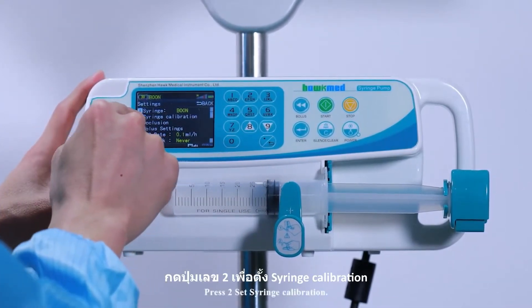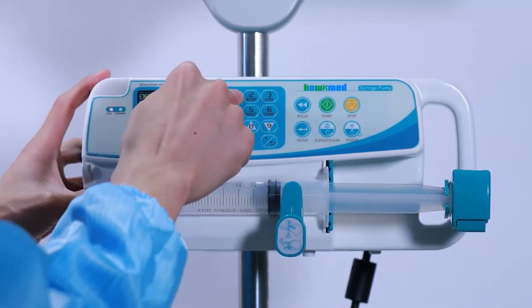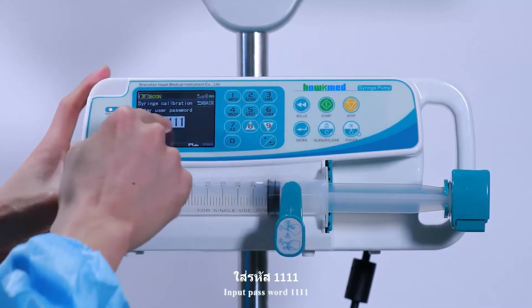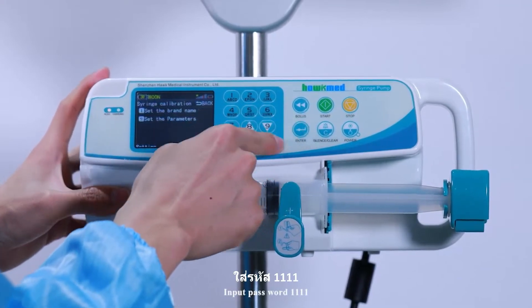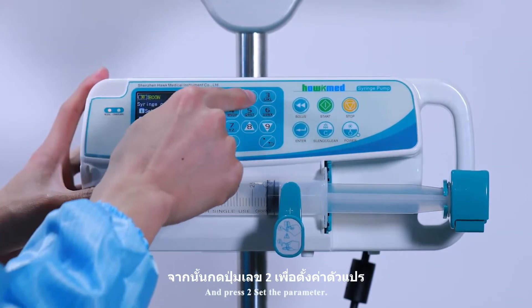Press 2 to set syringe calibration. Input the password 1111. Release button 2, then set the parameter.